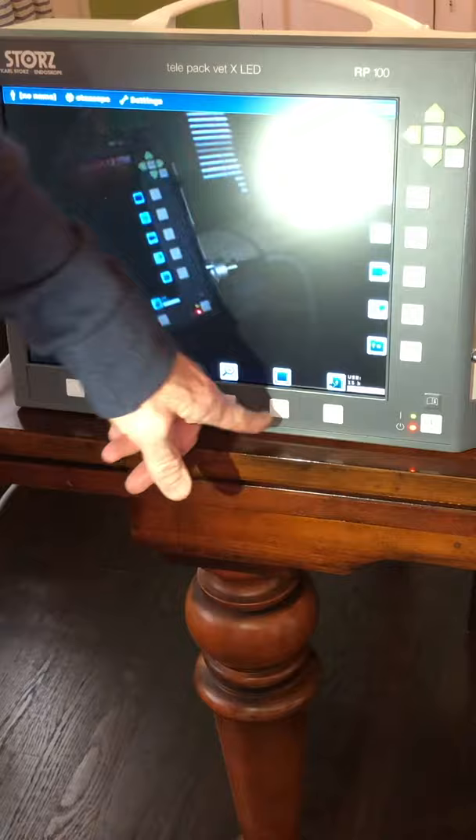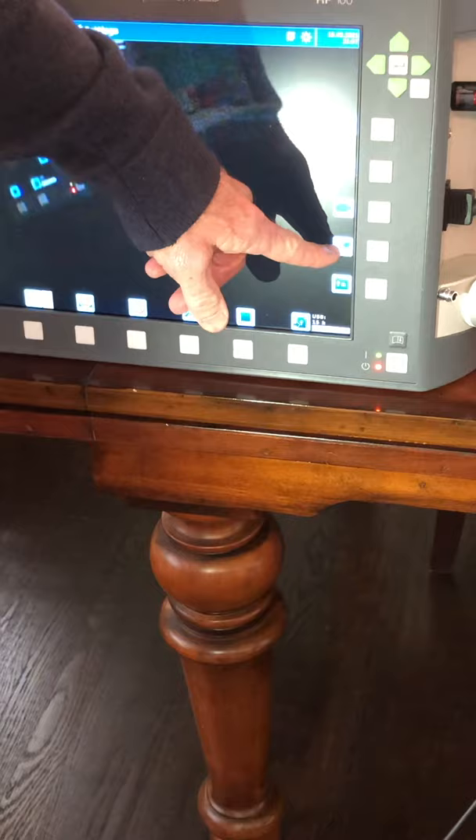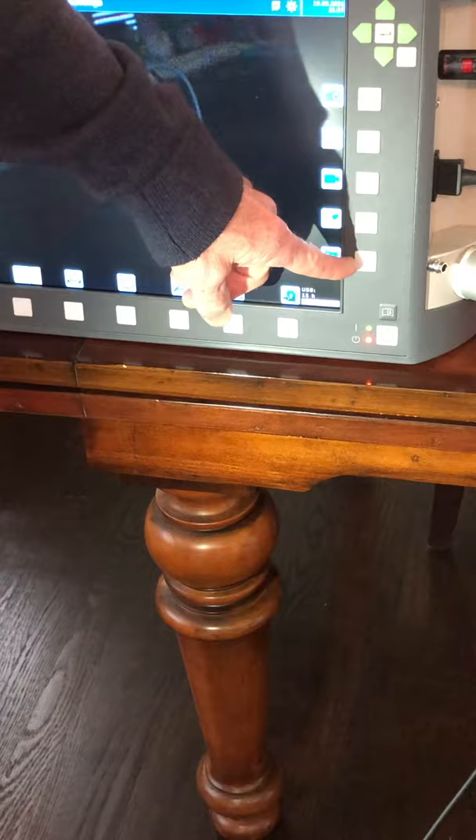You can take a picture with that button. This is a freeze button. This is the video start and stop. This is a microphone, and that's used for stroboscopy, which we're not doing here. This button reviews your current case, and this one reviews all the cases on the flash drive.